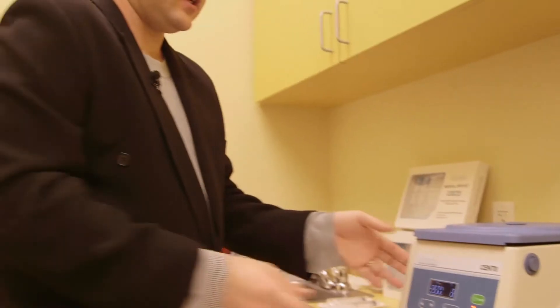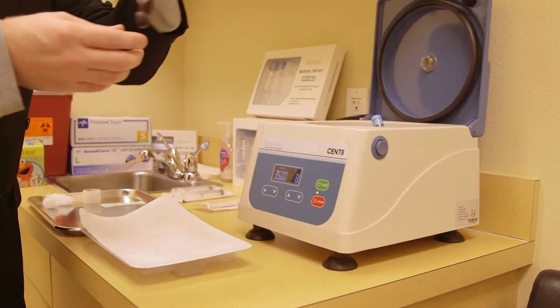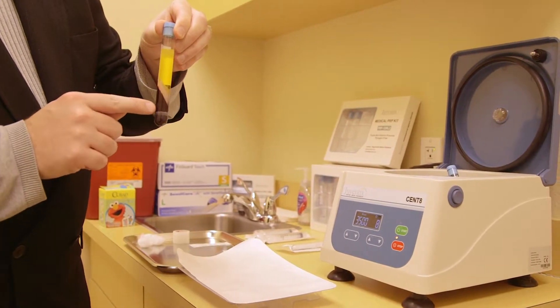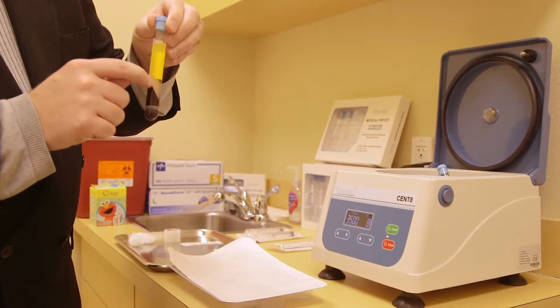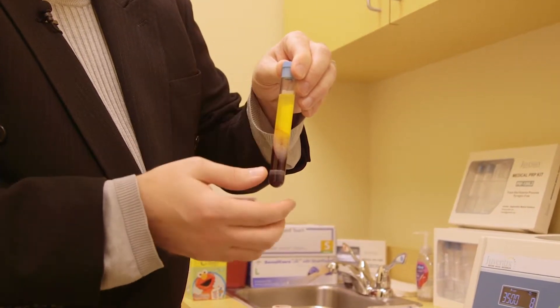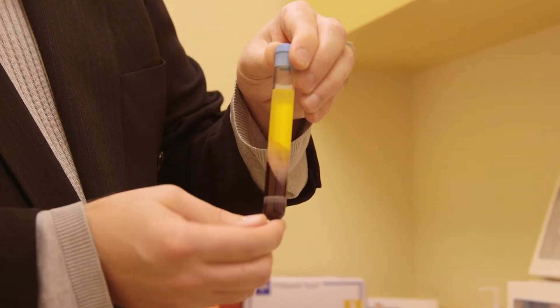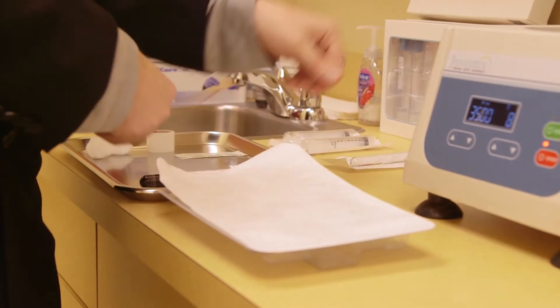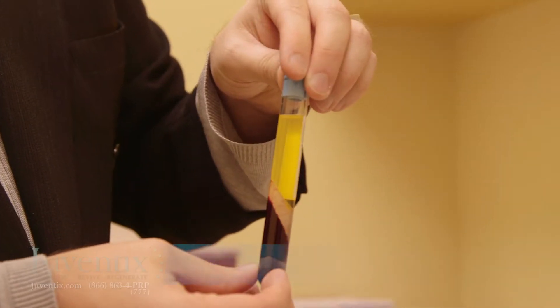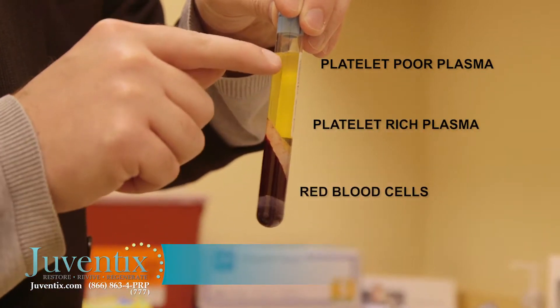After processing is complete, remove your tubes from the centrifuge. You will see that all the red blood cells and granulocytes have been captured underneath the polyester gel separator layer, and that all of the platelet-rich and platelet-poor plasma has been captured above the polyester gel separator layer.